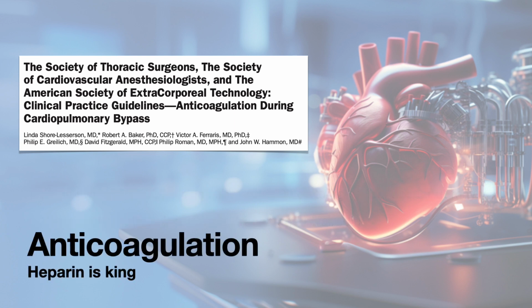During cardiopulmonary bypass, we are proposing to take the patient's entire blood volume, drain it through plastic hoses into a bucket next to the bed, and then pump it through more plastic hoses to an oxygenator and back into the patient. Needless to say, keeping the blood from clotting is vital to avoiding a therapeutic misadventure. Heparin remains the gold standard for anticoagulation during cardiopulmonary bypass and really should be utilized whenever it is reasonable to do so.